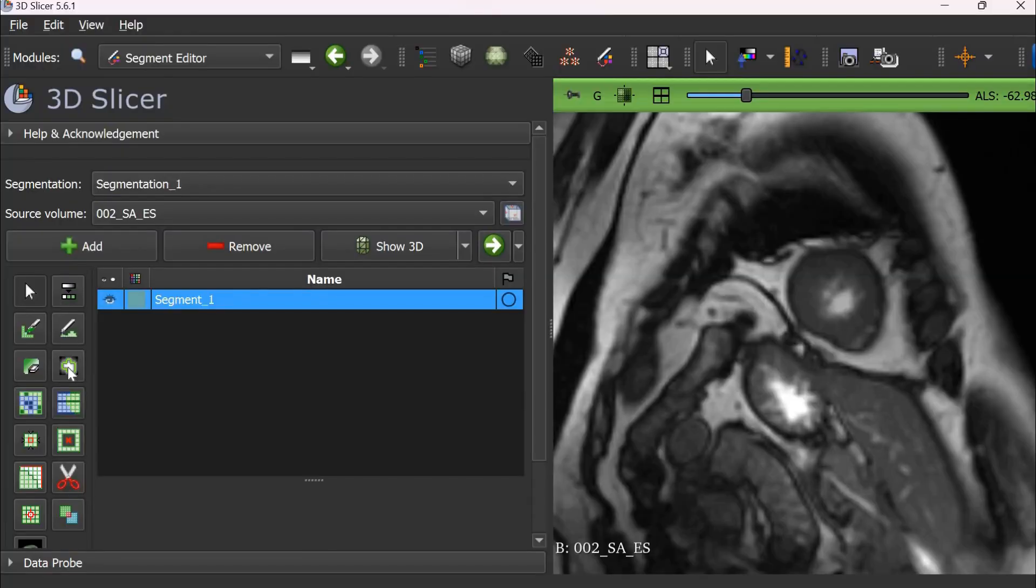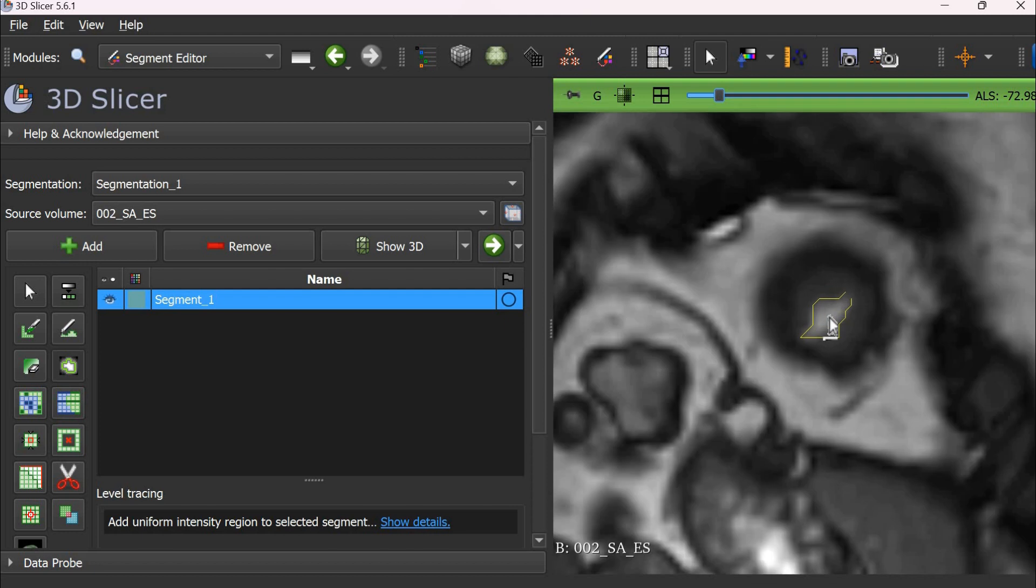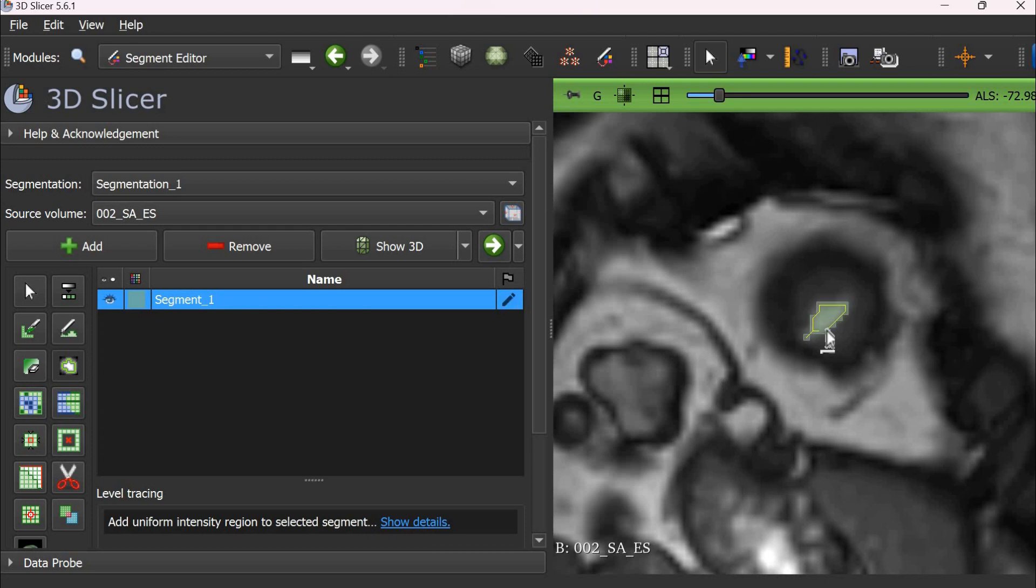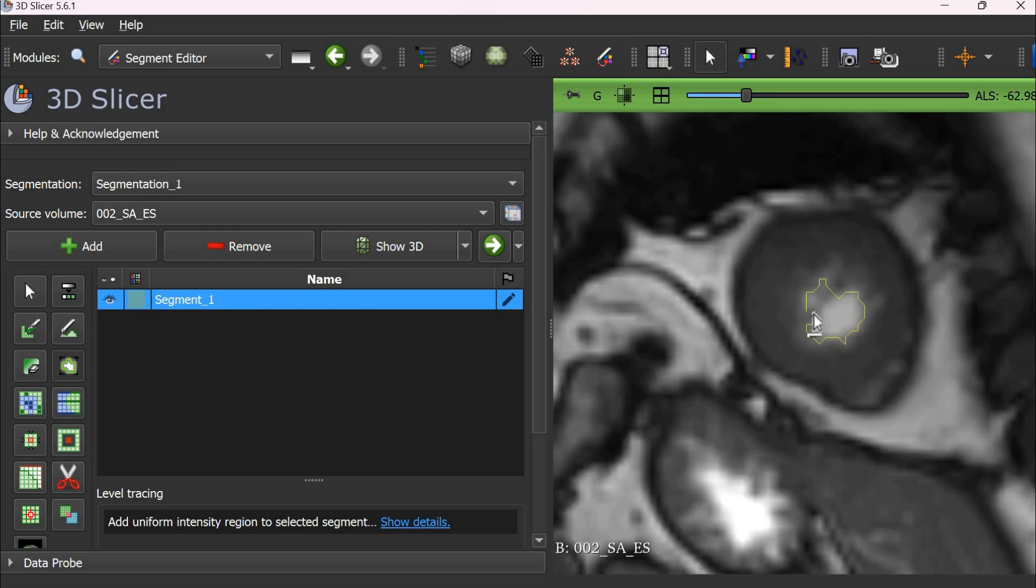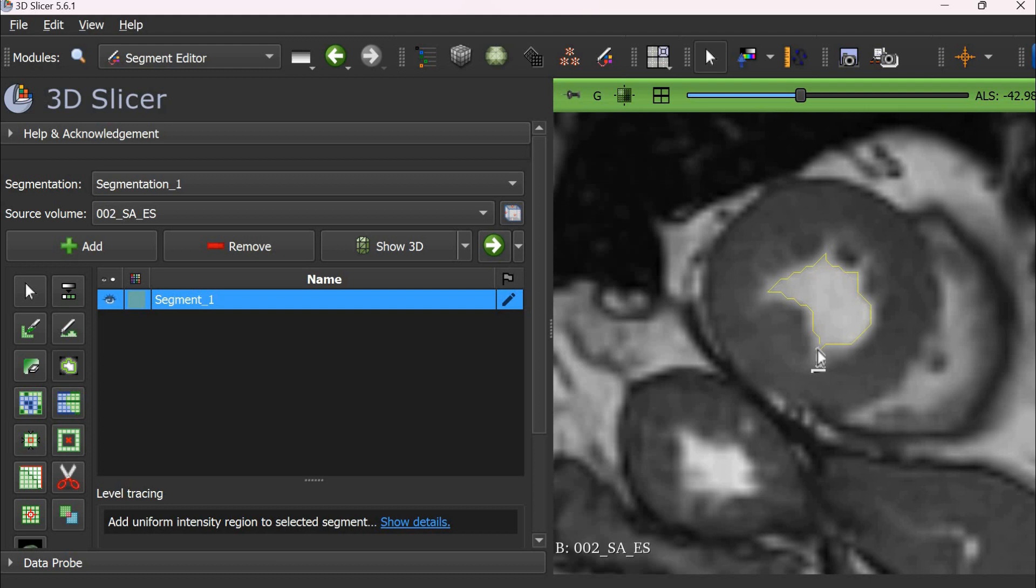Select this option and go to the image. The algorithm will automatically suggest ROIs based on where you place your cursor. Choose the mask which is most relevant and then click on the shape. It will be applied to your image. Similarly for other slices in the stack.